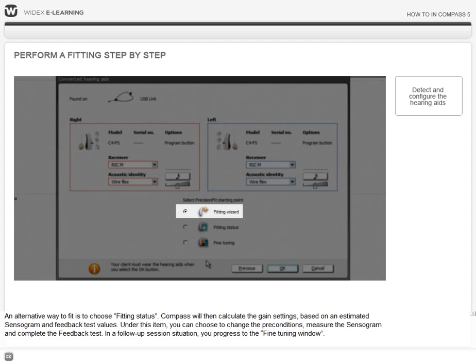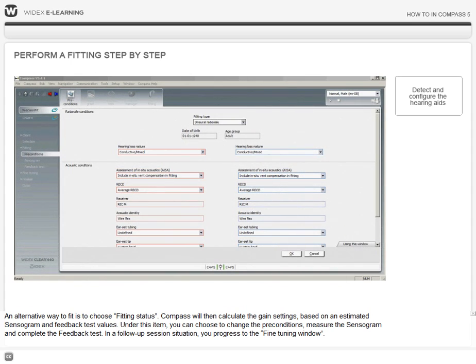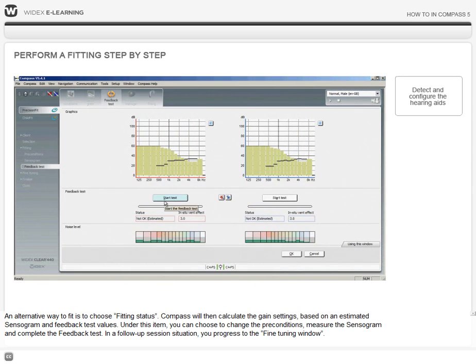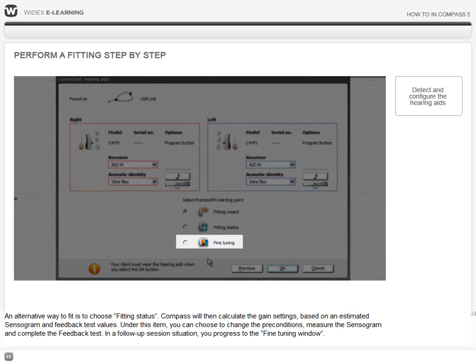An alternative way to fit is to choose Fitting Status. Compass will then calculate the gain settings based on an estimated sensorgram and feedback test values. Under this item, you can choose to change the preconditions, measure the sensorgram, and complete the feedback test. In a follow-up session situation, you progress to the fine-tuning window.